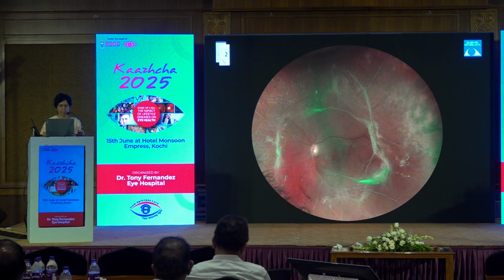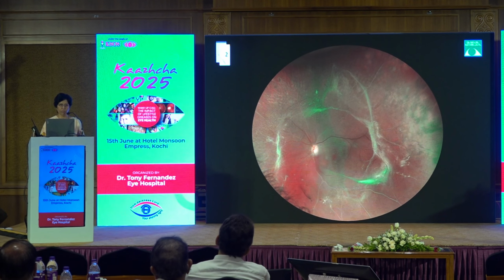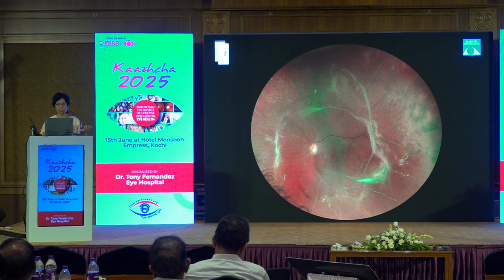After 4 years, this patient came with macular detachment, and that is the time when I did the surgery for this patient. So surgery outcome is okay, silicone oil removal has been done, but patient's vision is about 3/60. So that is the vision you expect in such a situation, which will be less than what preoperatively he had.